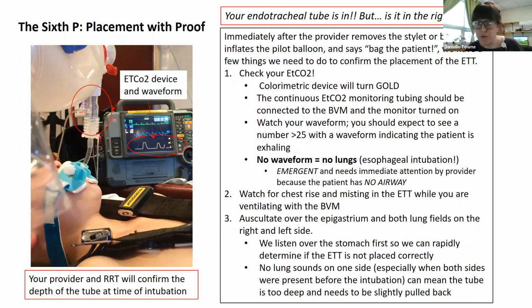So if that were to happen, what do you do? You say, hey doc, I have breath sounds on the right side, I have no breath sounds on the left side. Well, maybe they can go back in with their blade and look and deflate the balloon, pull it back a centimeter or two, and then have you listen again, reevaluate. And you say, yeah, great, now I have breath sounds on both sides. Beautiful. It was just a little too deep in the first attempt, and that's okay.